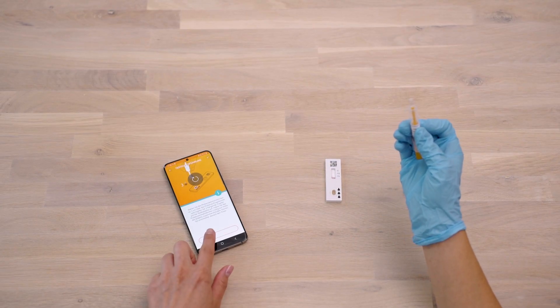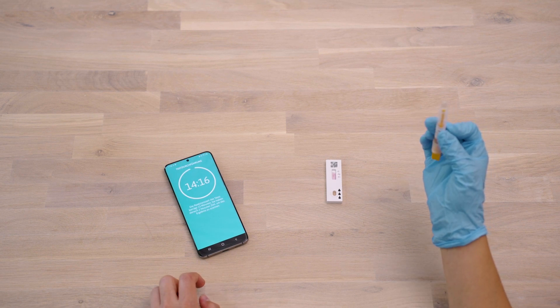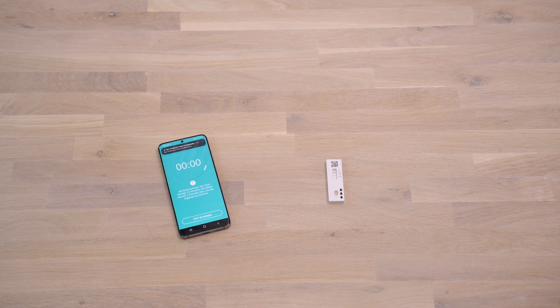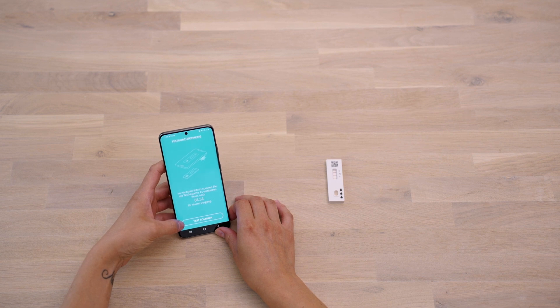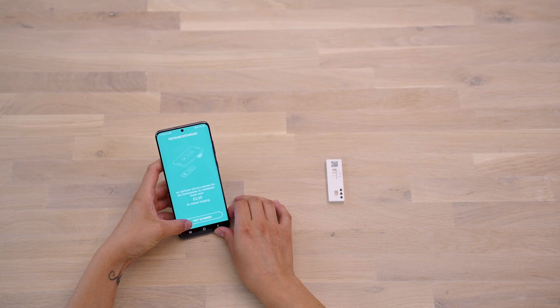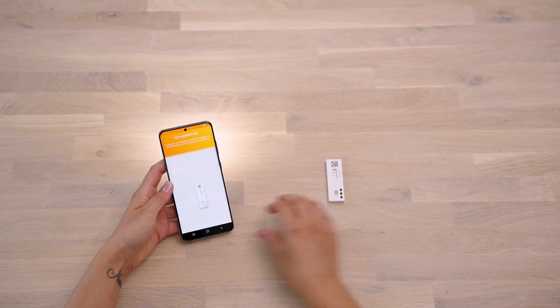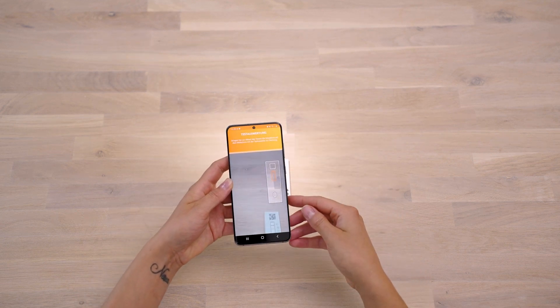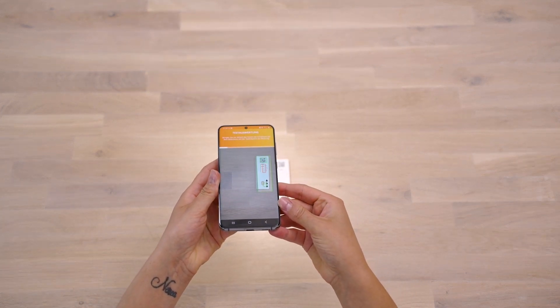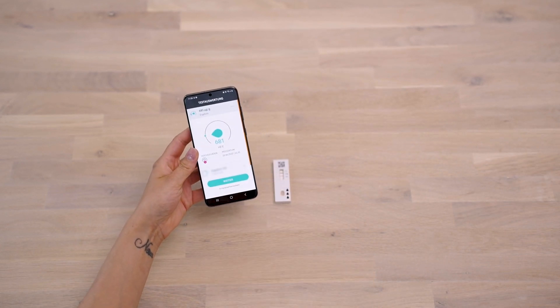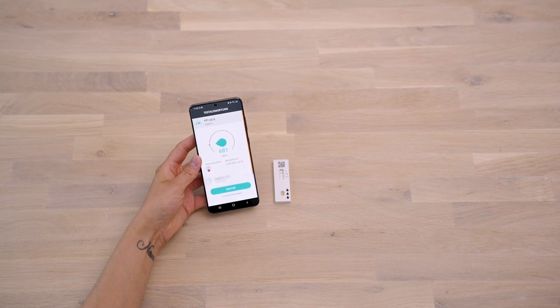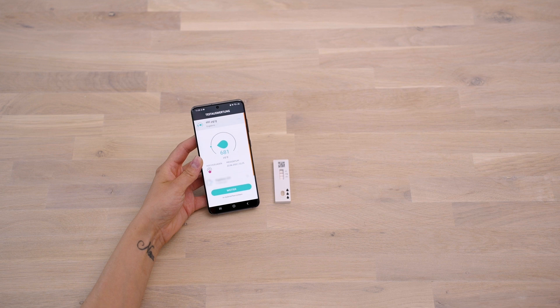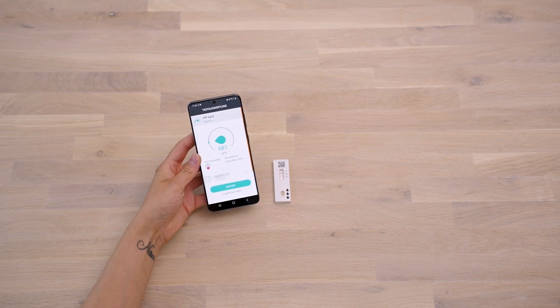Apply three hanging drops by squeezing the sample collection tube at the label. Start the timer immediately after sample application. After 15 minutes have lapsed, a timer alarm will remind you. You then have two minutes to evaluate the test. If the step is not done within the specified time, the result will be invalid. To analyze your test, hold your smartphone parallel over the test cassette and align the template on your display with the test cassette. Based on the color intensity of the gradients, the Smart Test CalProtectin app will determine your result, which will be displayed on your smartphone along with other important medical information. If you have given permission, your test result will also be shared with your medical professional.